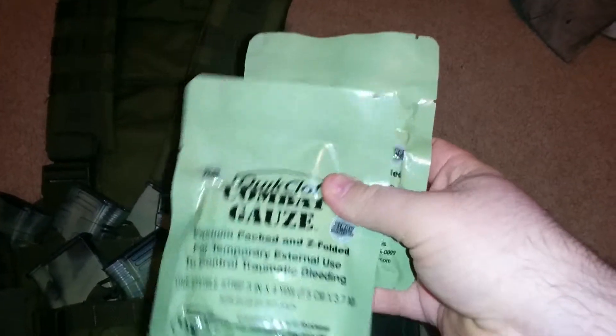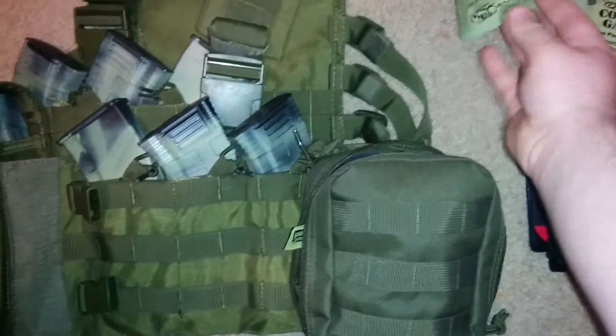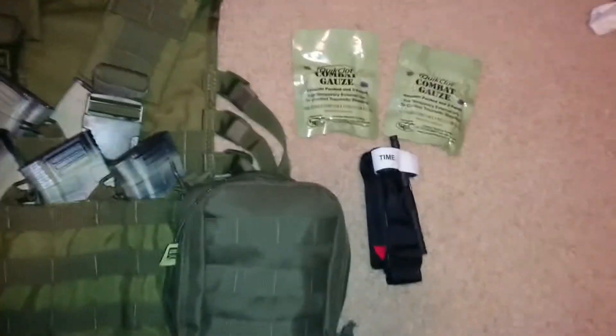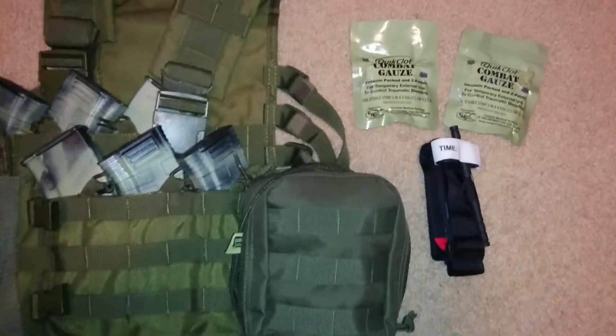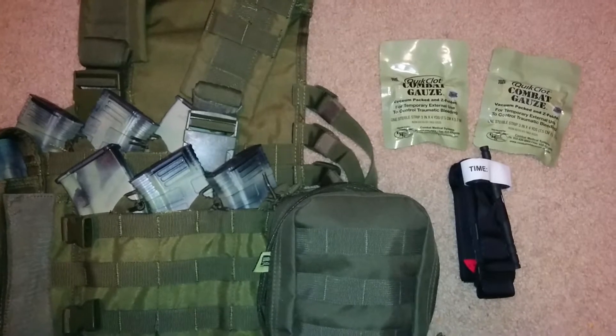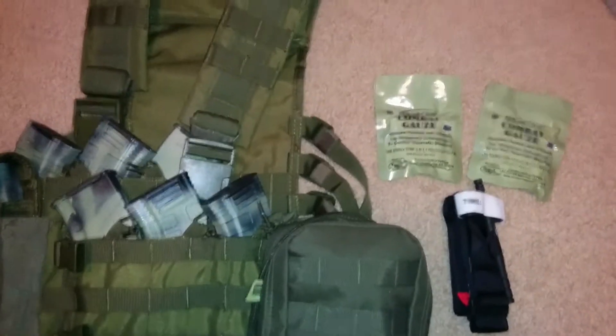Next, I have two packs of combat gauze. I'd like to have three, because if you do get shot — and God forbid you get shot more than once — you're going to need enough to pack each wound and stop the bleeding so you don't bleed out.